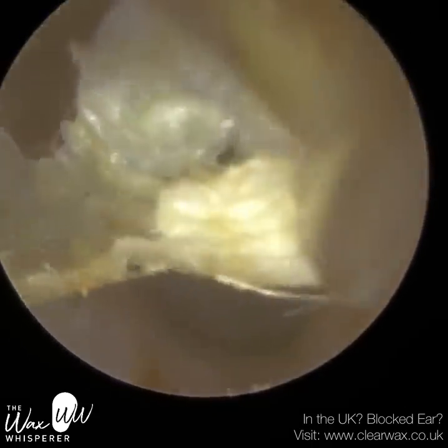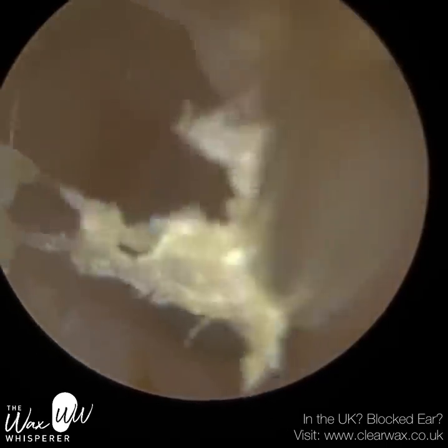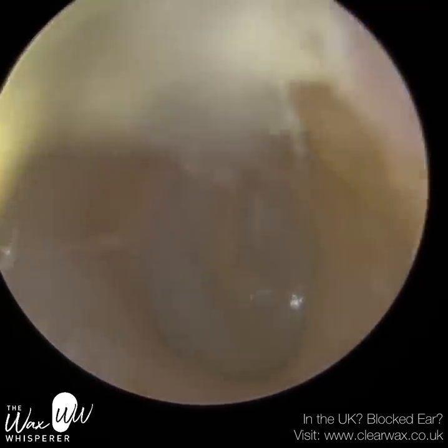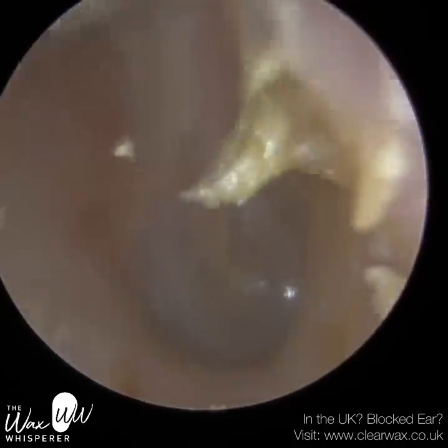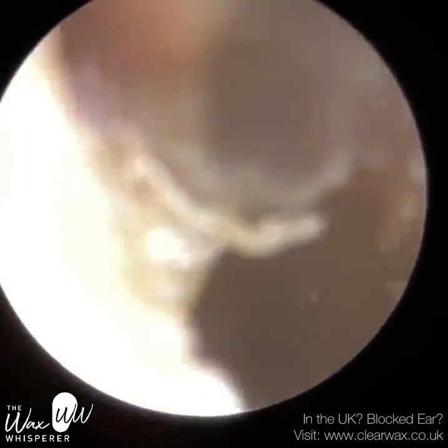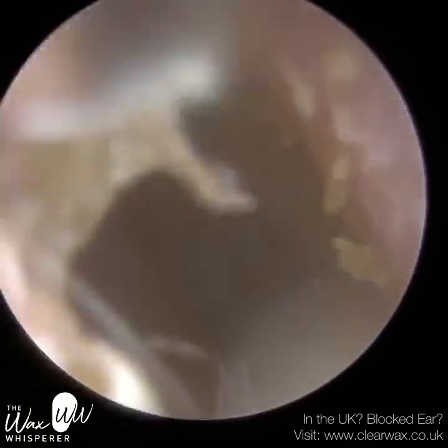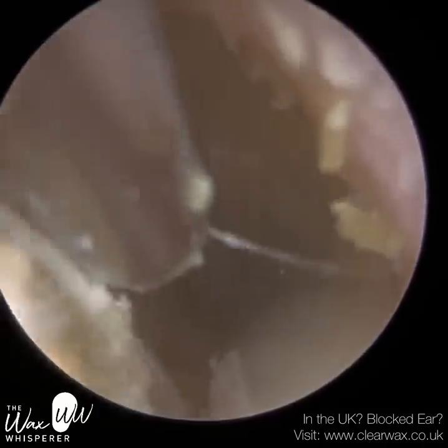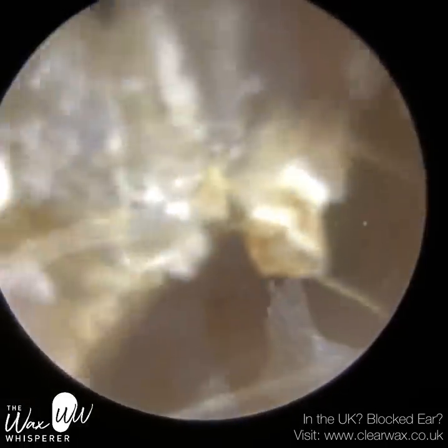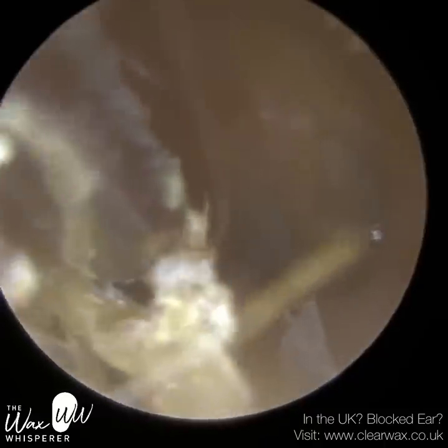But I would say this is just more age-related scar tissue — it's just opaque. As I said, they have got some otitis externa, some eczema of the ear canal, some dry skin, so I'm just gently peeling that away using a fine-end suction tip. This is just near the entrance on the back part of the ear canal — it's a bit crusty there. I'm just going to peel that away; it's almost like a snake skin, that piece.